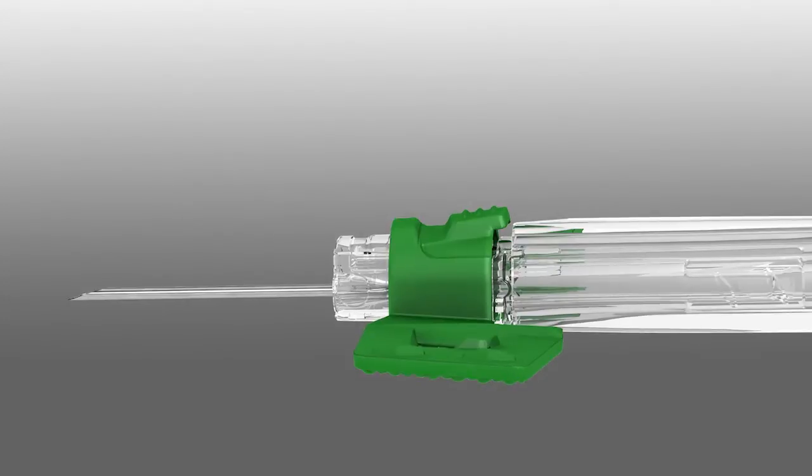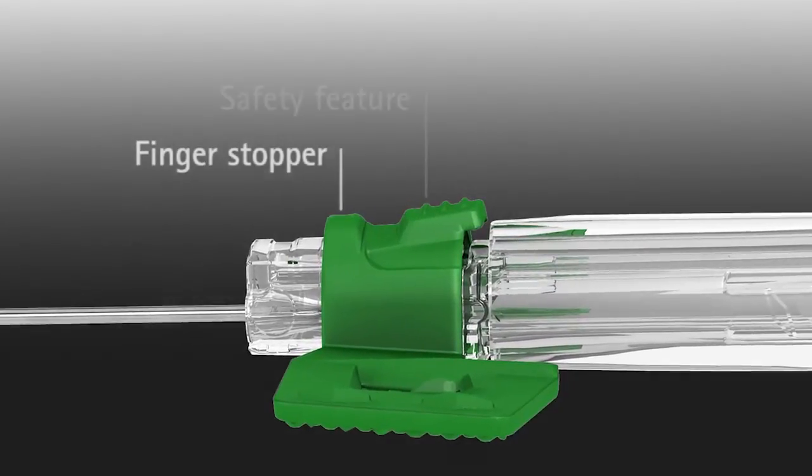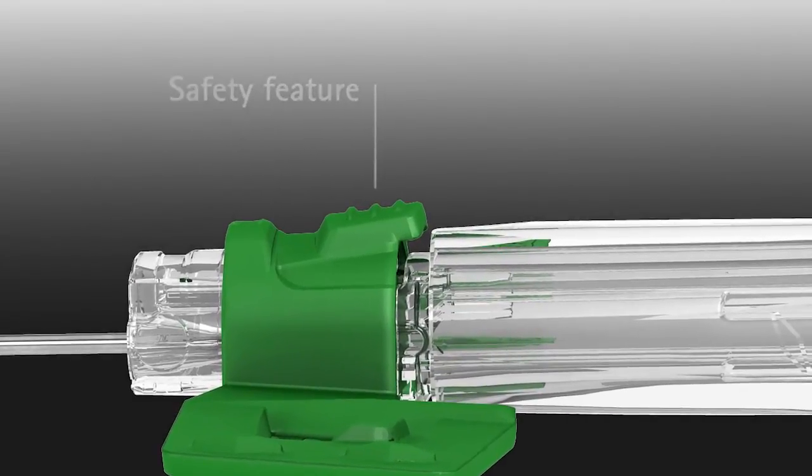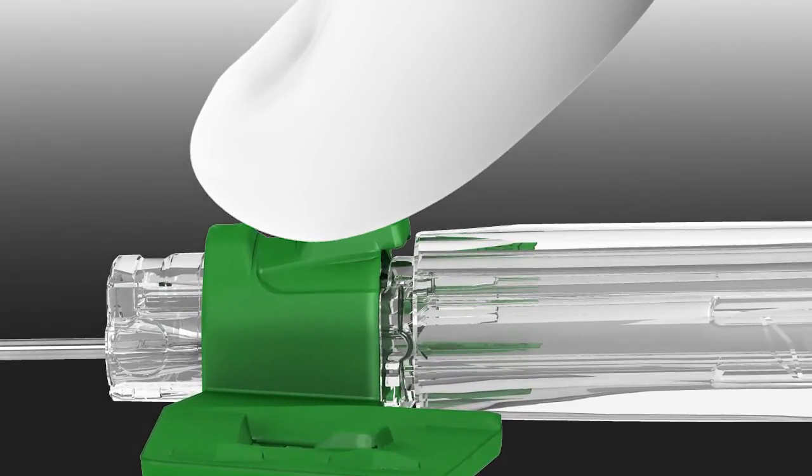At the end of the procedure, the safety feature can easily be activated with one hand while the needle is still in the patient's vein. The integrated finger stopper prevents the index finger from slipping towards the sharp needle tip upon activation.